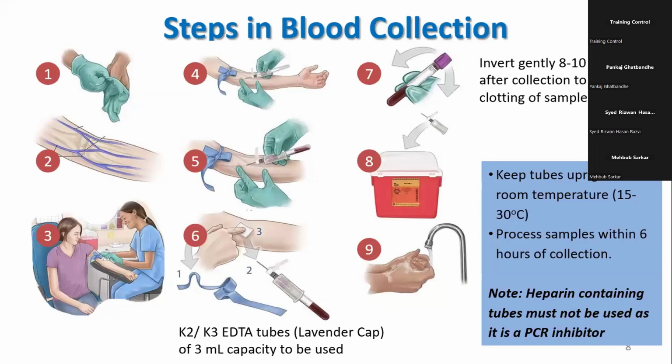Okay. These are a few of the steps of sample collection. First, the safety of the technician or the person drawing the blood is very important. So ensure you have the right PPE, you're wearing correct gloves, being powder-free gloves, and your apron, mask, or face shield, whatever is required, or whatever COVID guidelines you are following. Locate the vein, clean the area, let the area dry, and then draw the blood with the same single prick.